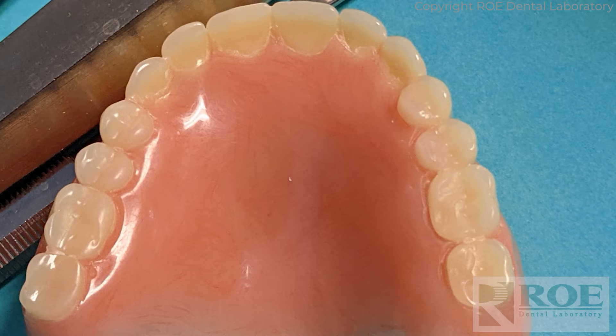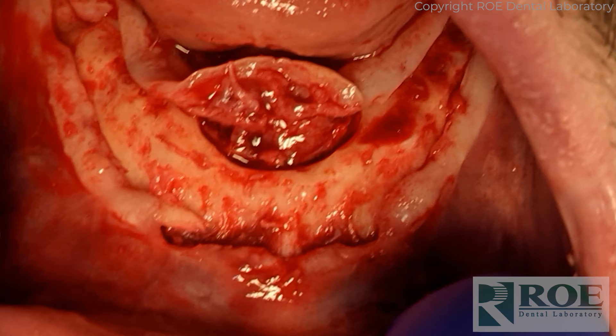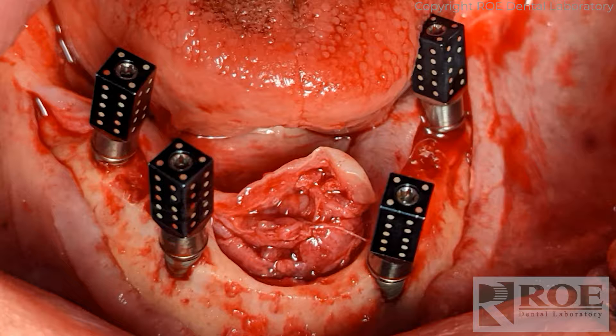The patient came to surgery that day with a denture they had been wearing for quite some time. This is a mandibular all-on-four surgery, freehand. The doctor goes through the normal process: incision, flattening the bone, taking measurements, placing four implants, placing multi-unit abutments, and on top of the multi-units the ICAM scan bodies are placed. The doctor then went through the process of acquiring the scans.